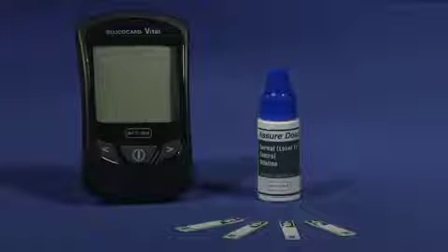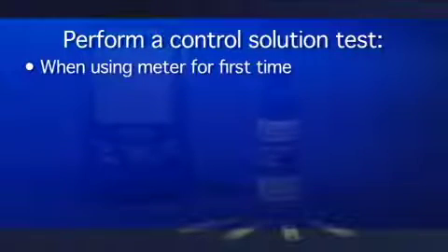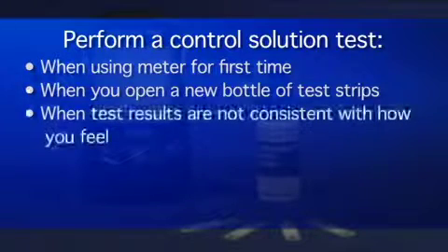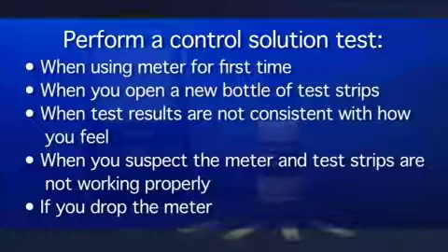To perform a control solution test, you will need your Glucocard Vital Meter, test strips, and control solution. It is recommended that you perform a control solution test when you use the meter for the first time, when you open a new bottle of test strips, when test results are not consistent with how you feel, when you suspect the meter and test strips are not working properly, or if you drop the meter.